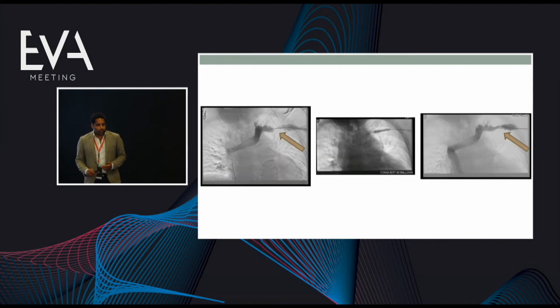This is the typical example of a patient with a left arm fistula who has a symptomatic subclavian vein stenosis. And if we sort of eyeball this and put a 10 millimeter balloon in and inflated the balloon and got this sort of waist appearance which obliterated with a higher pressure, you'd feel quite happy about this if you only looked at the angiogram images and the flow on the right looked okay. You may be tempted to accept that as an adequate treatment.